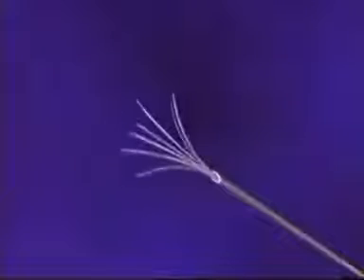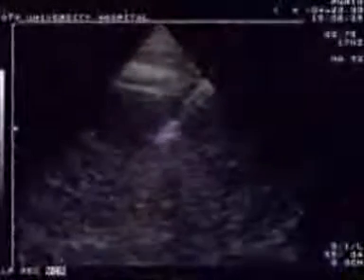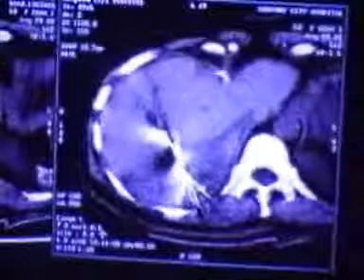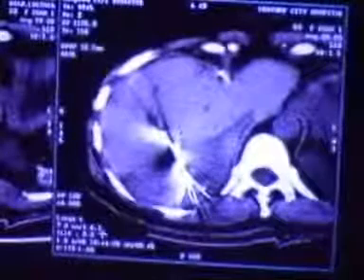Then the electrode array is slowly deployed. Slight forward pressure is recommended for proper deployment. Ultrasound can be used to monitor deployment and detect any displacement of tissue. If doing a staged ablation with the Starburst XL, deploy completely to check positioning and then retract to the starting position.